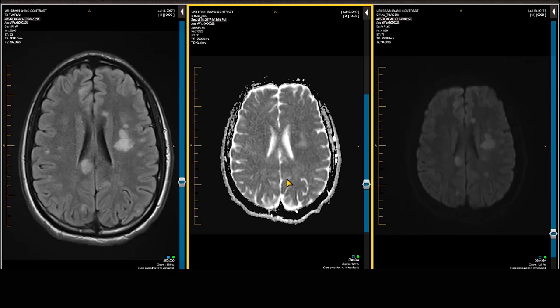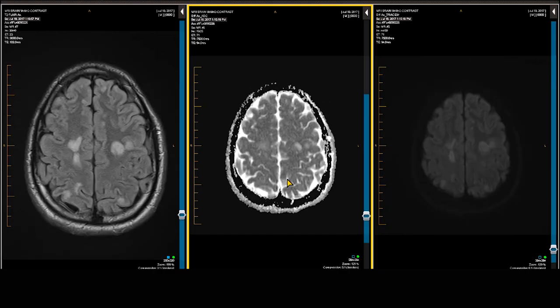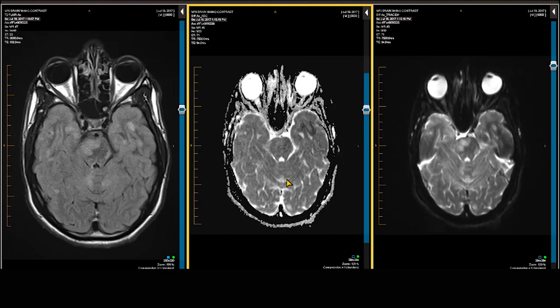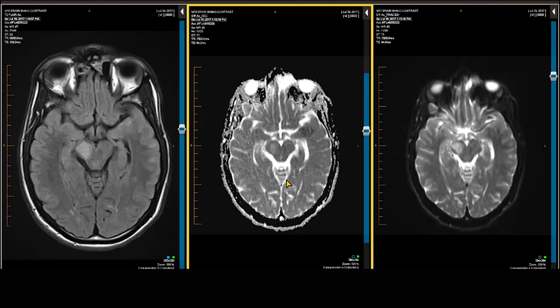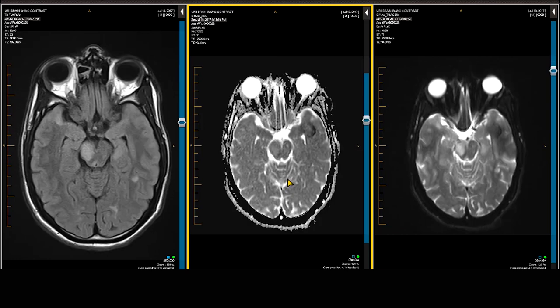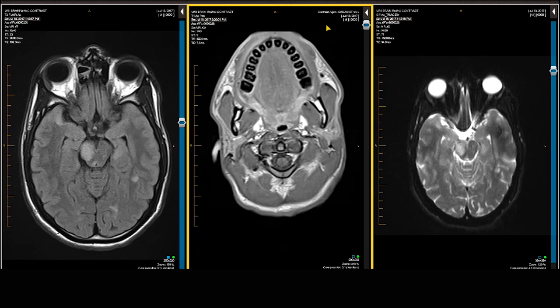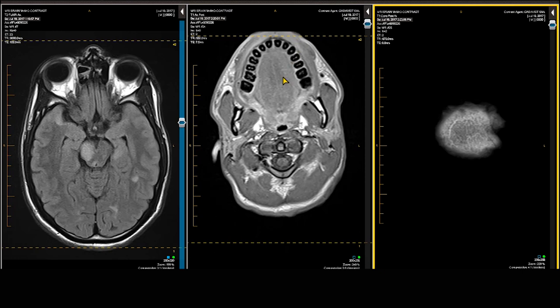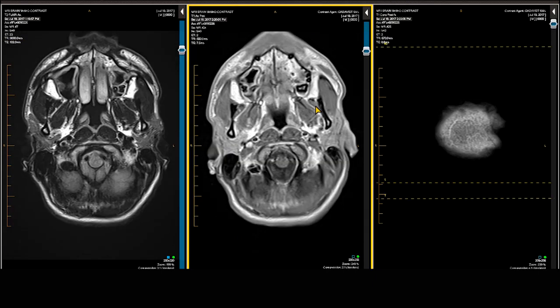All of the other demyelinating plaques are just bright in signal intensity without dark signal. Down here we are seeing some artifact in the left lateral temporal lobe. I am now pulling down the T1-weighted scans to show whether the demyelination is showing contrast enhancement, indicating active blood-brain barrier breakdown.